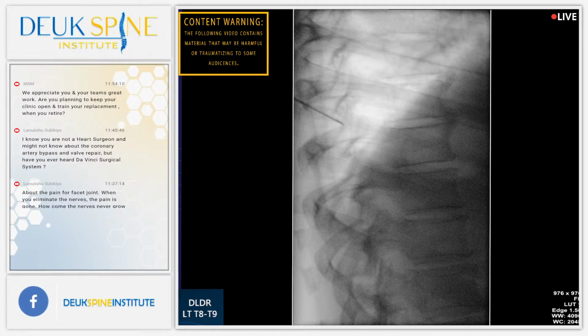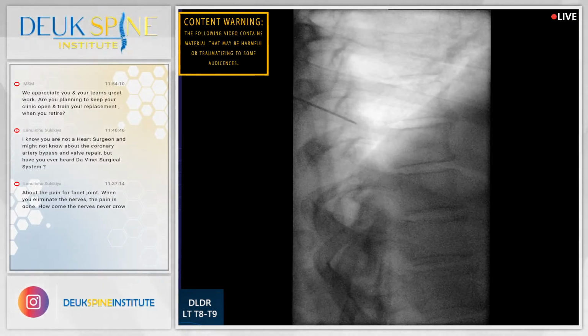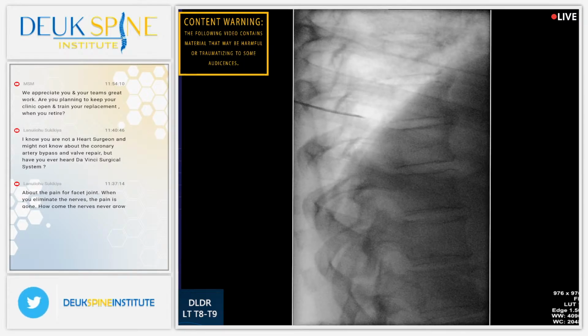And I just don't know that we have a path medial. I'm not feeling a path. Shot. Does have a fair amount of arthritis back here, which is surprising.